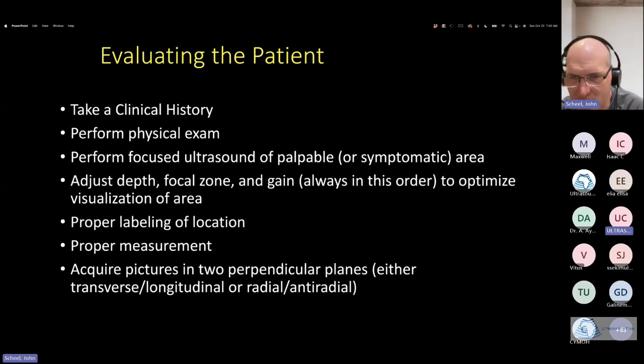For example, if a patient comes to you and says, I have a mass and it's located in my left breast and I never felt this before and I'm good about checking, it's something that should play in your mind that this is something more serious. But if they say, you know what, I felt this mass, it hasn't changed in 2 years, but I decided to get it checked because I was in town, you might treat that a little bit differently from a clinician standpoint, even though breast imaging silos you into just focusing on the imaging.